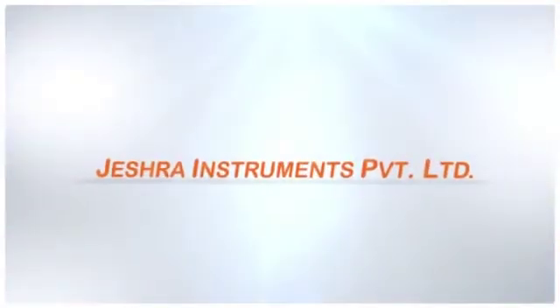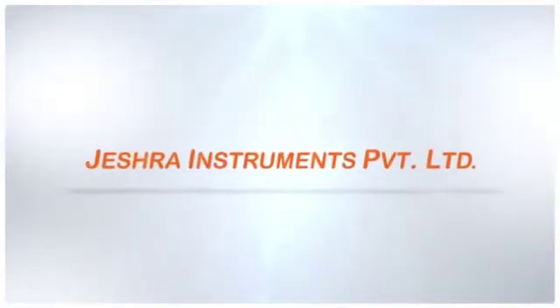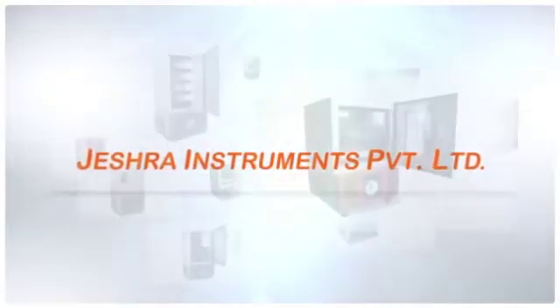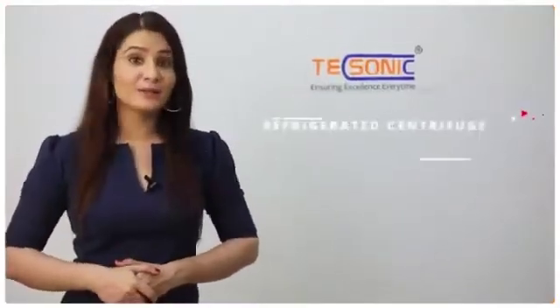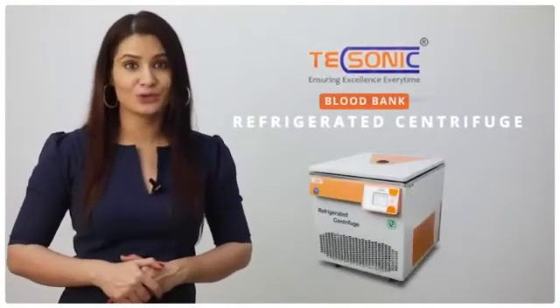Hello everyone, welcome you all to Jeshra Instruments Private Limited, one of the leading manufacturers of blood bank equipments. Presenting to you Tecsonic Blood Bank Refrigerated Centrifuge.